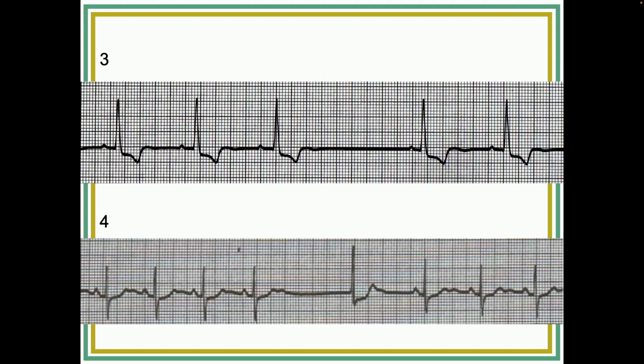Yes. Okay. So number 4, it looks like we have a sinus block, but since that QRS complex looks really different from the other ones, that's an escape. Correct. So again, I do use trick questions. I'm trying to trick you all the time. You got the true trick question because you were expecting either an escape beat or a premature beat. But you've got to keep factoring in what you already know, okay?